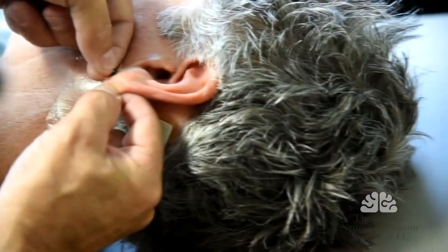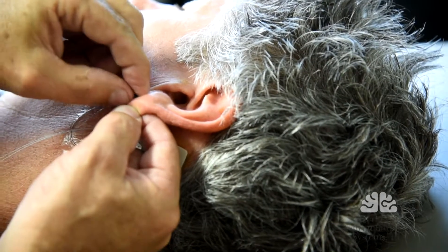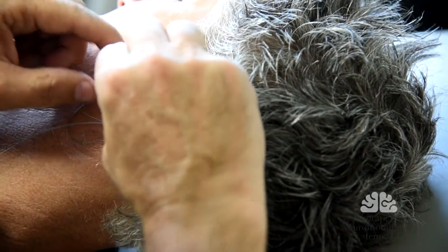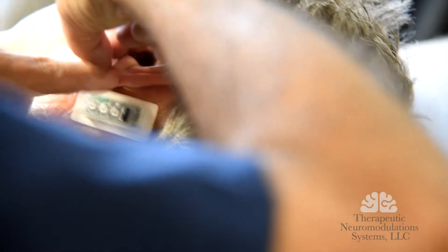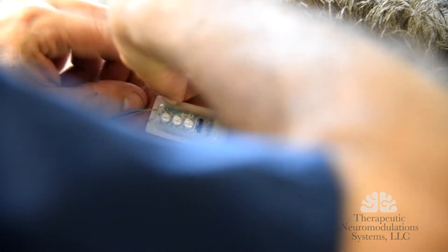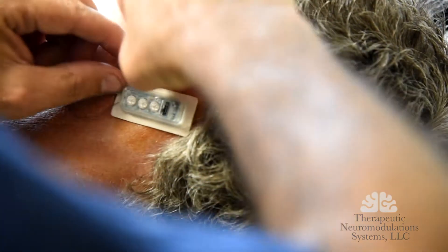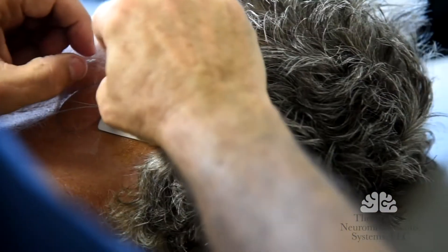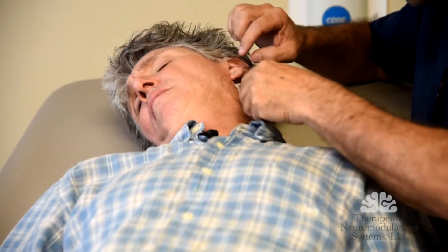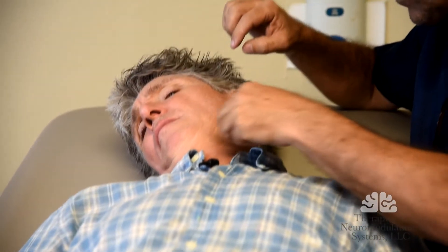This one. A little pinch. We're in. Now it's hitting hard. Is it? Here's where I'm going to rest. Are the leads color-coded? Like the ground? The ground is — how is that ground marked? The ground, you're going to see, is twirled. Yeah, like your plastic coat. So you don't have to isolate it.